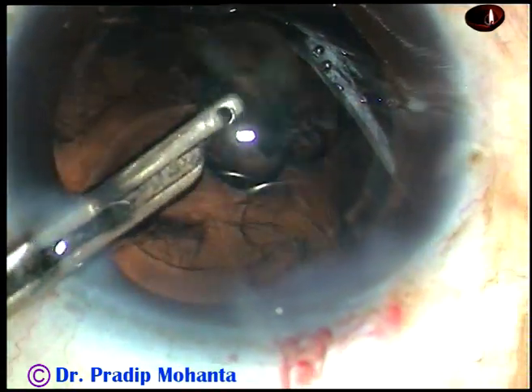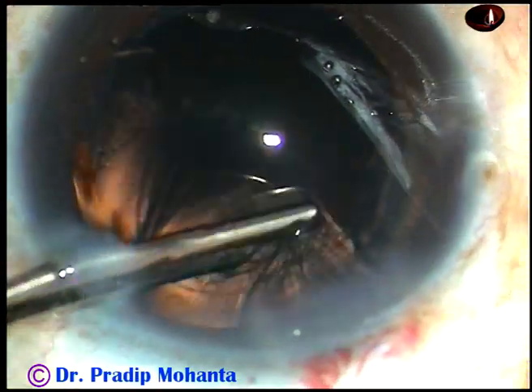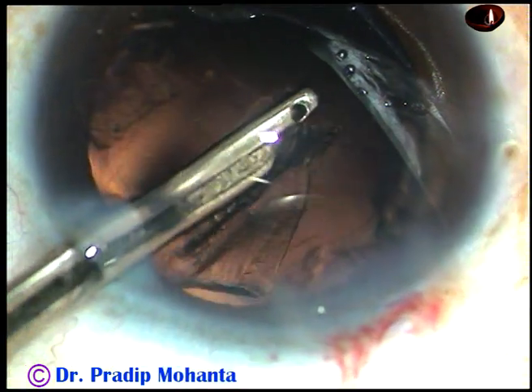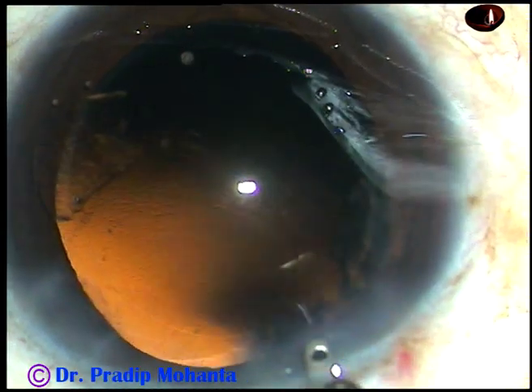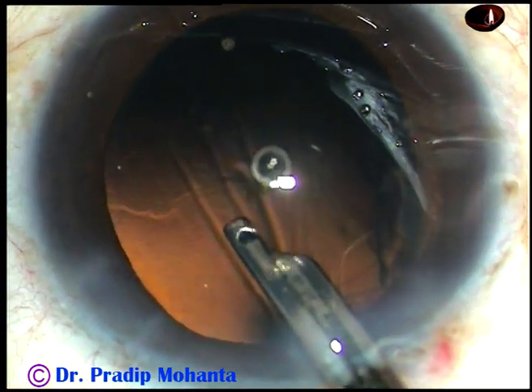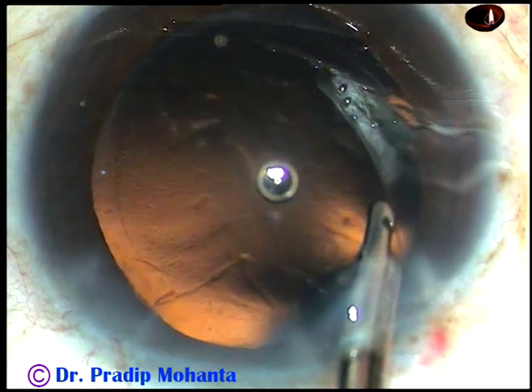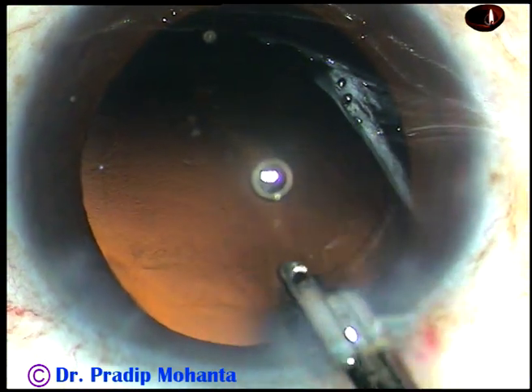And now, the cortex from the superior aspect is being removed from 10 o'clock to 1 o'clock. I can see there is a piece of nucleus or epinucleus lying at 10 o'clock. So what I do is I flush out some fluid towards it, and it is escorted out.